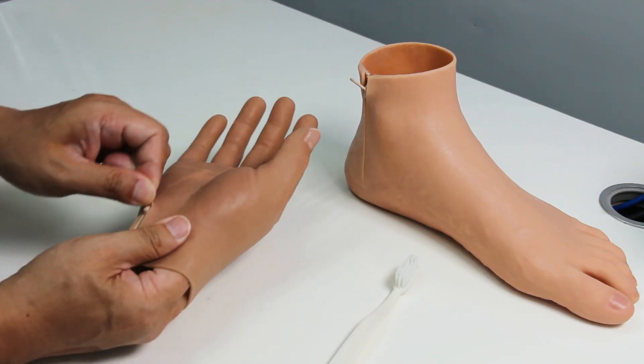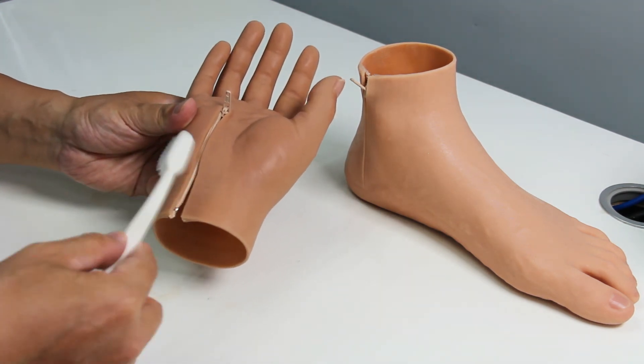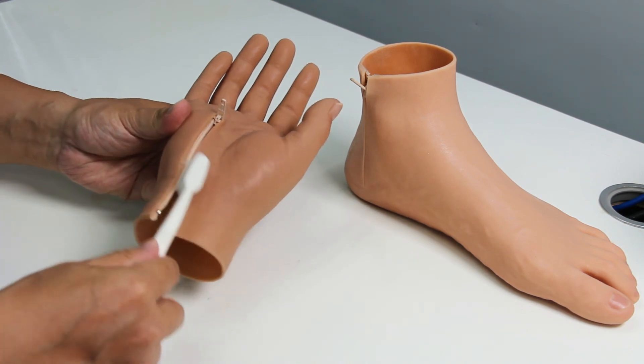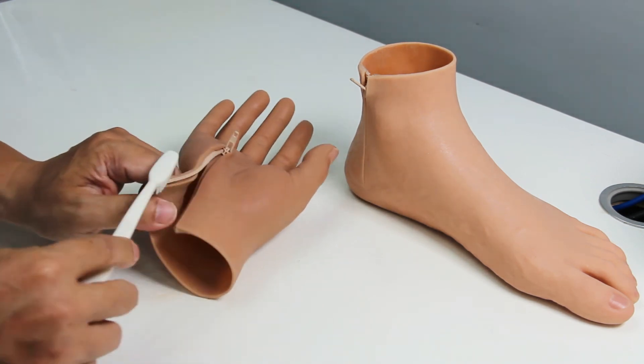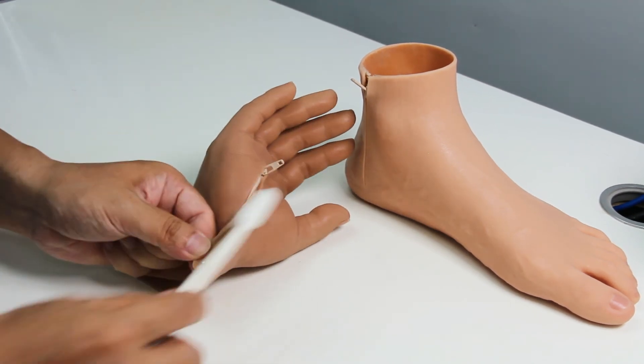Keeping the zip clean will also make it long lasting. To clean the zipper, simply let water or mild soapy water run over the zip and use a toothbrush to brush the teeth, so all the dirt accumulated during the day can be removed.